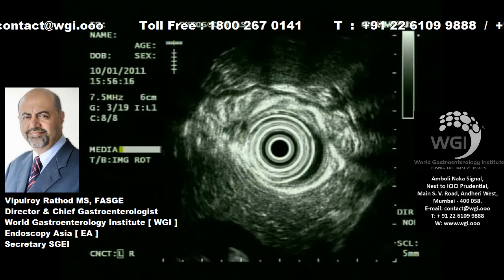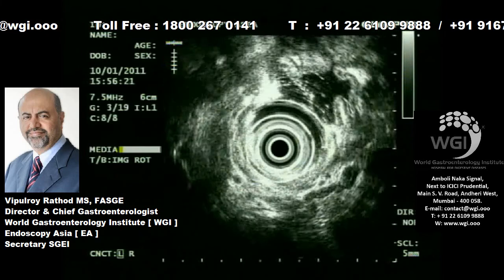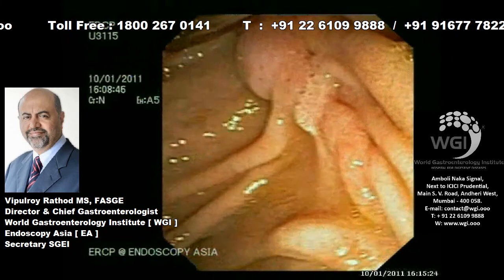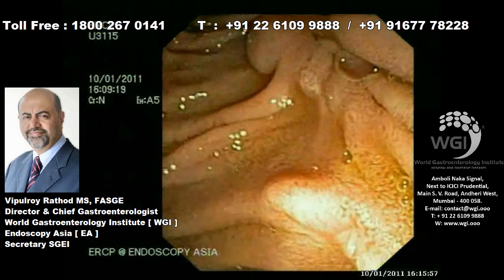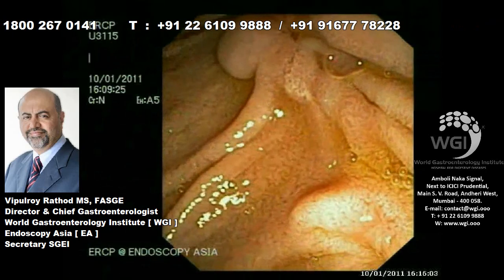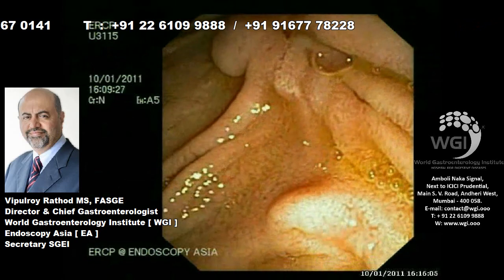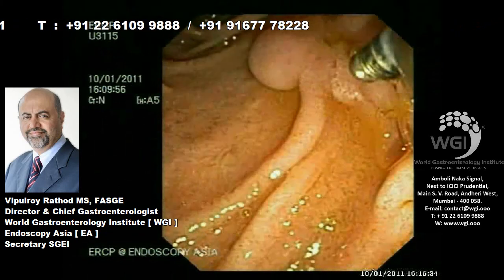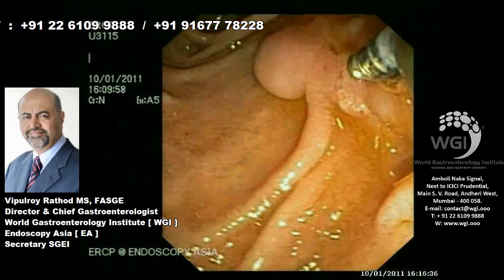There was no parenchymal calcification in the body. The patient has undergone an attempt of endotherapy through the major papilla in the past, and therefore you can see a little bit of sphincterotomy here.